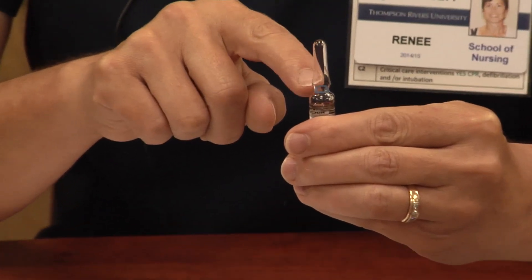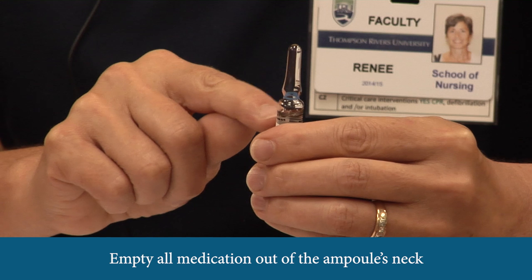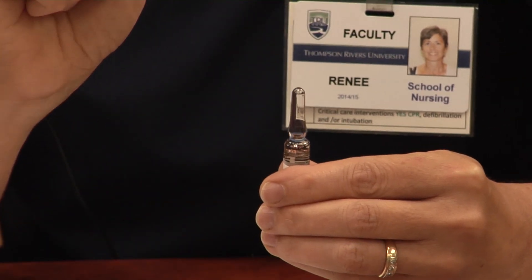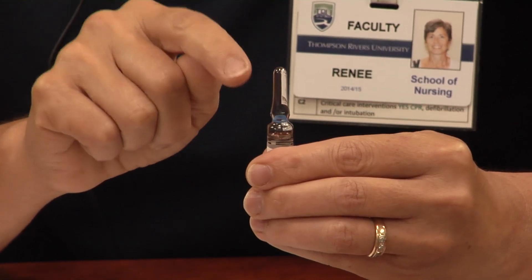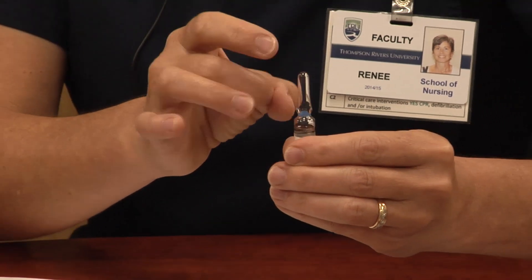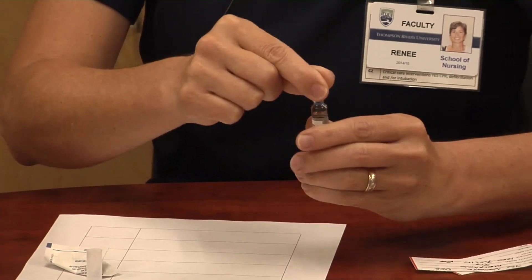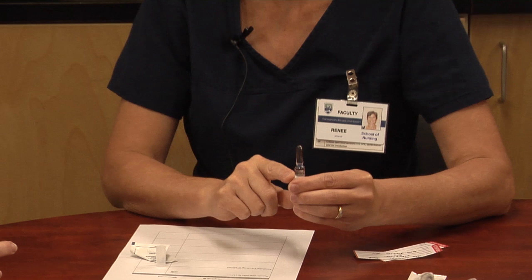You always want to make sure the medication is out of the neck. The supplier will tell you how many milliliters they provide, and sometimes they'll give you a little more, but not a lot. If there's a significant amount in the neck, you likely won't have the correct dose. To get it down, you can either flick it, or grab it and turn it in a circle — that shakes everything up and gets it to the bottom.